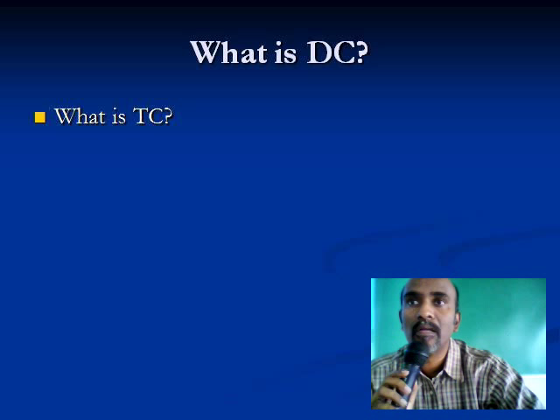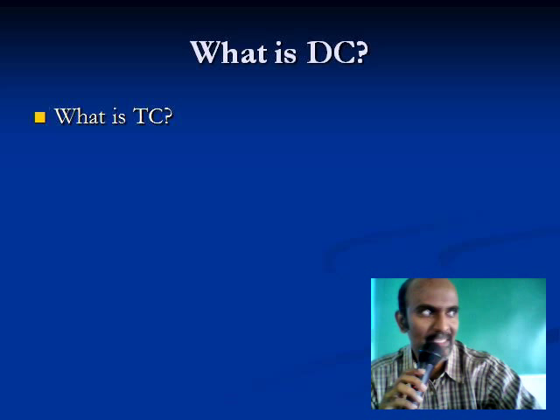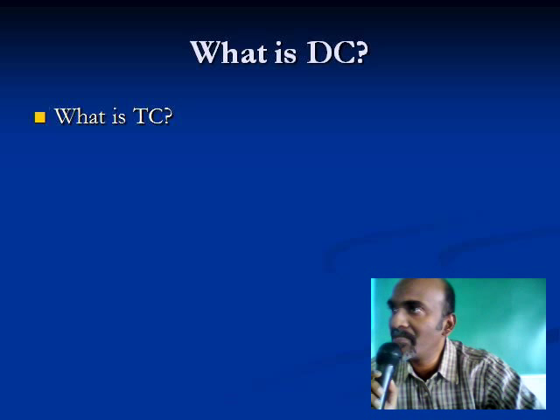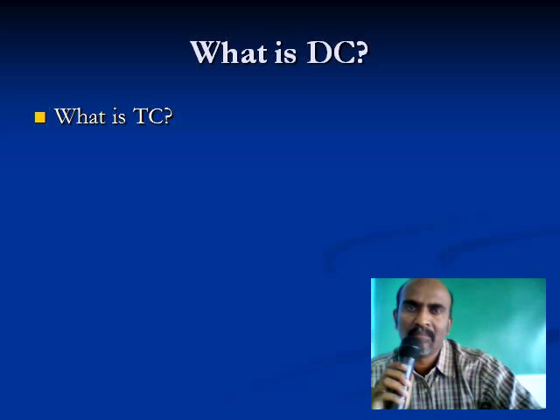Then what? And give it as a percentage. Different types of WBCs, count of different types of WBCs expressed as a percentage.